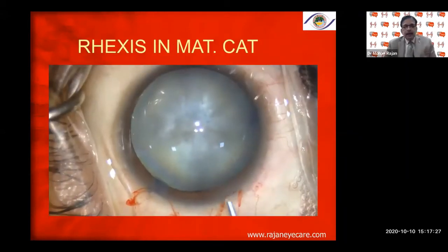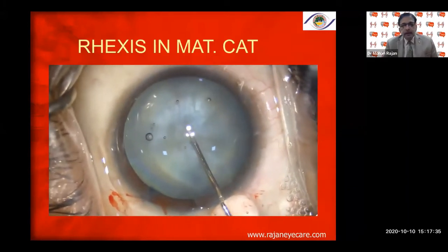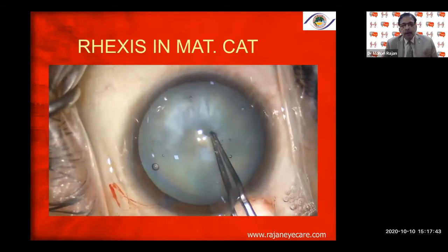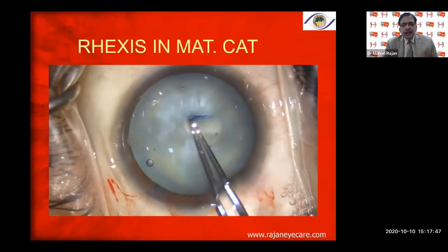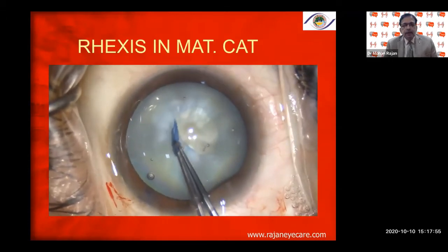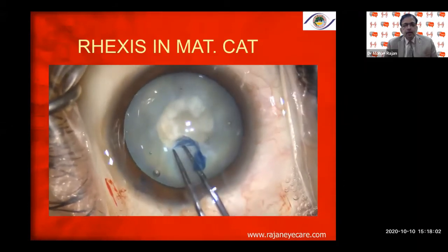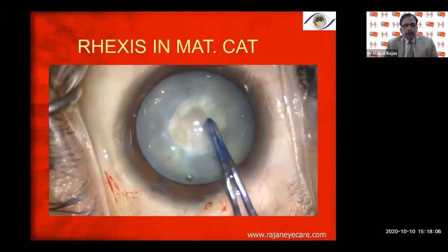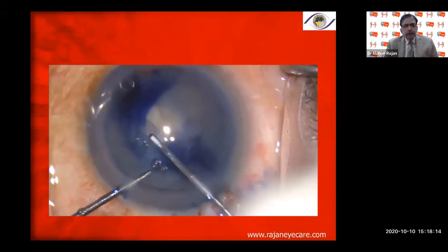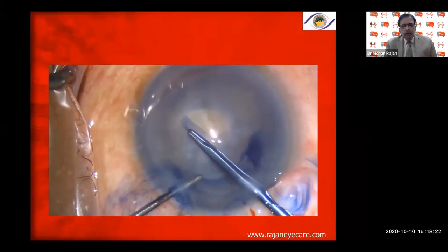In an intumescent cataract where the intralenticular pressure is very high, I make a small opening with a 26-gauge needle to decompress the anterior compartment, then proceed with the capsular rhexis by going around every three clock hours. Coming out or staying inside, catching the base of the capsular rhexis — this is shown again in another patient with a fairly dense white cataract using the micro capsular rhexis forceps.